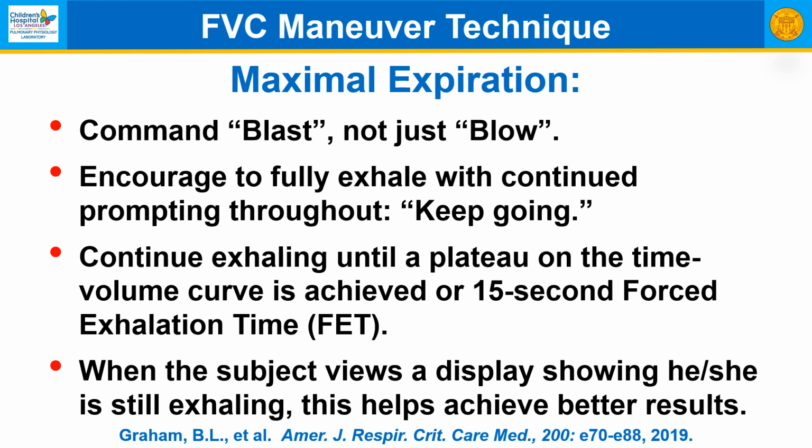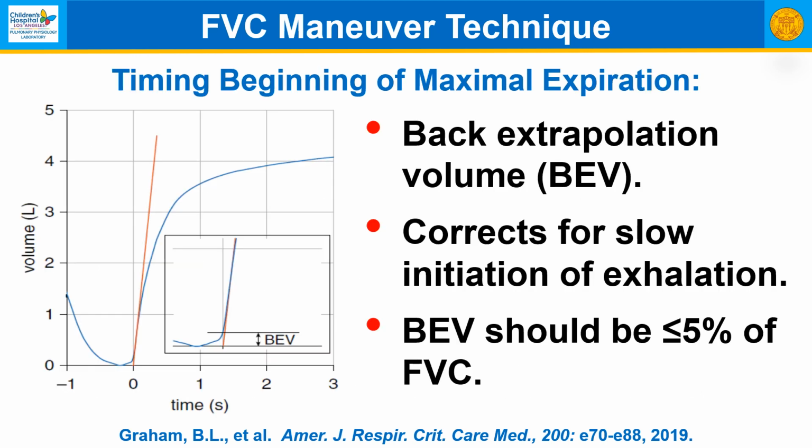This is uncommon in children. But the plateau, yes. When the subject views a display showing that he or she is still exhaling, this helps to achieve better results. So there are a number of things for children, like birthday candles, a number of things like that.